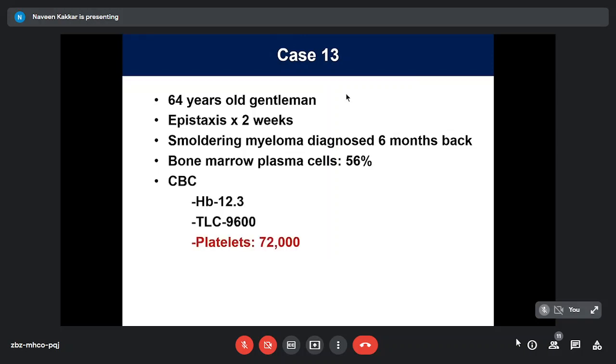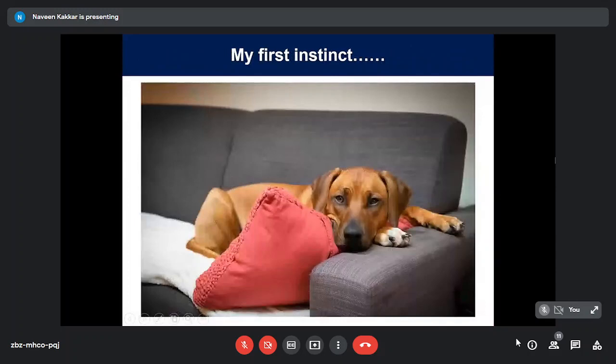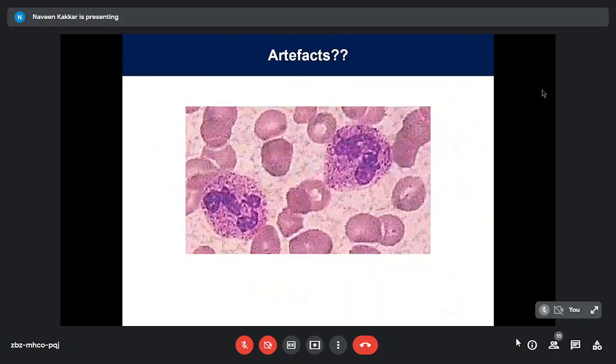His CBC showed thrombocytopenia. And the first slide that I saw at 5 o'clock, the background showed debris, and I thought these were artifacts there, lots of these granular artifacts. And my first instinct was, let's say artifacts, report the rest and go back home. And I was so lucky I did not do this. My temptation was this: I was almost about to get up. Then I just noticed one thing, which was that there were these dark neutrophil nuclei, but these debris were not sitting on the nucleus. They were in the plasma.